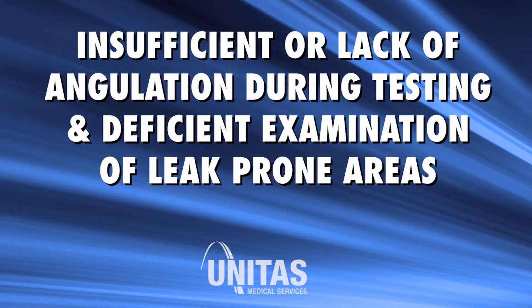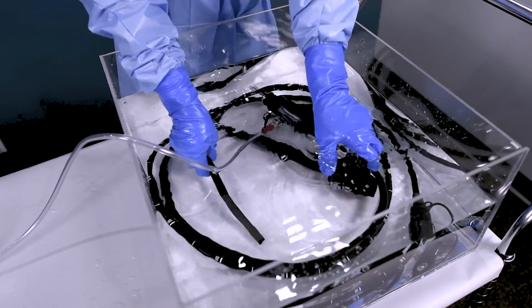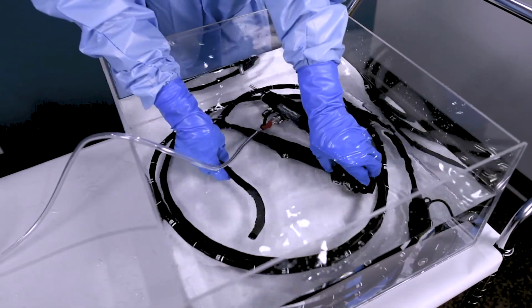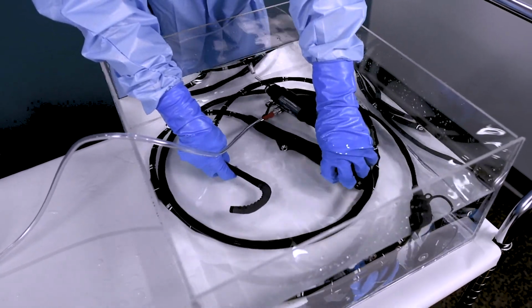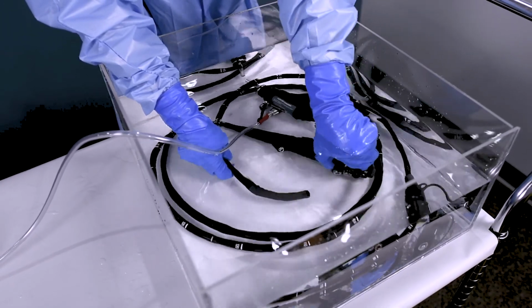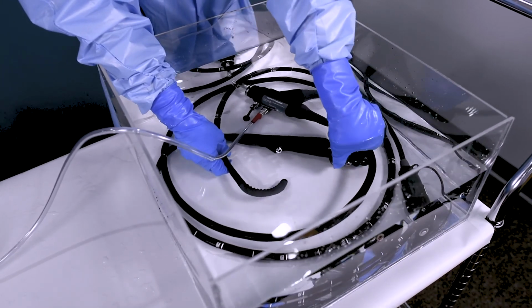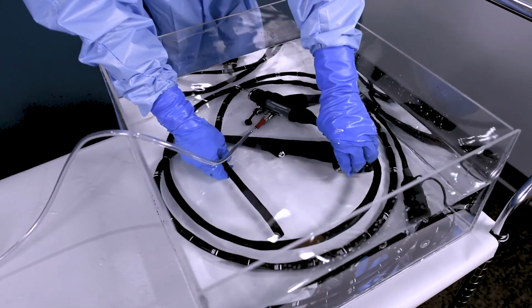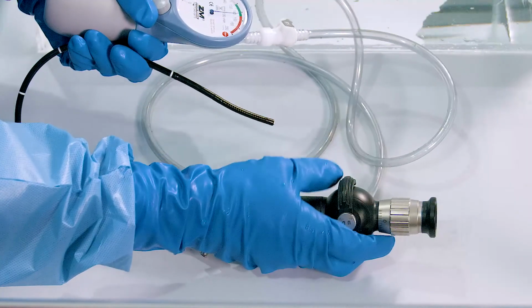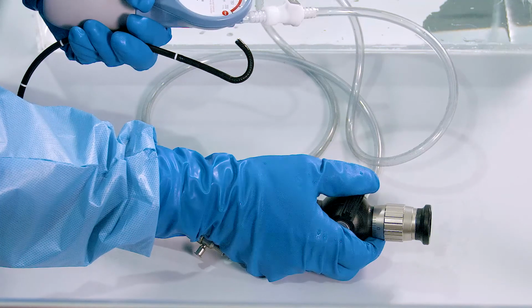Insufficient or lack of angulation during testing and deficient examination of leak-prone areas. All flexible endoscopes need to be angulated during the leak test process. Just visualization of the control knobs, video buttons, and the distal end may obscure or mask leaks without the proper full angulation in all directions. Manipulation of the buttons and tube, and extra examination of these areas during manipulation.